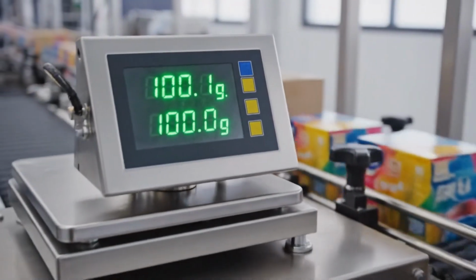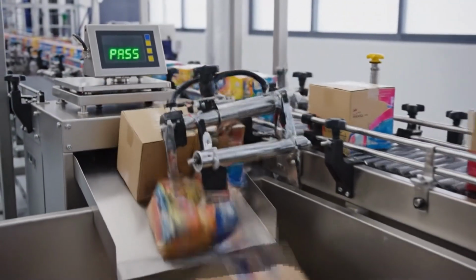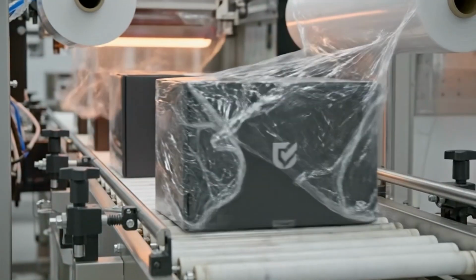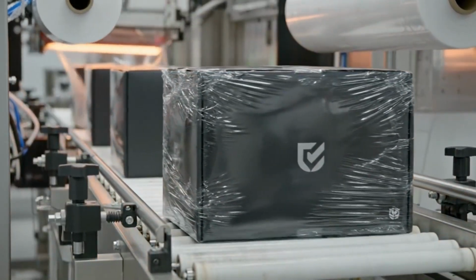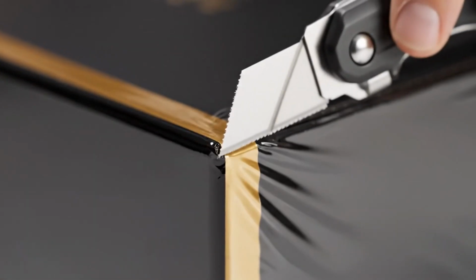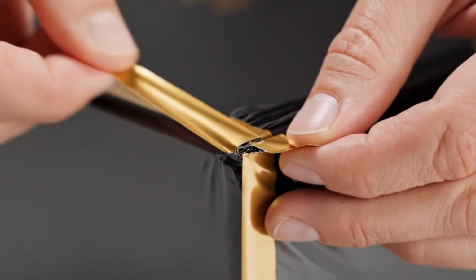If a box is even 1 gram light, it is rejected. We guarantee the exact count in every pack. The overwrap adds a premium feel and keeps the retail packaging pristine during its global journey. Small details make the difference between a product and a premium experience.